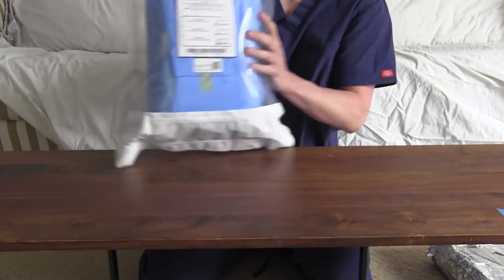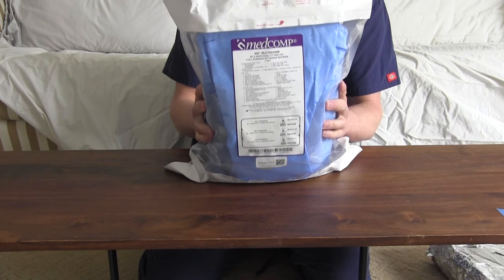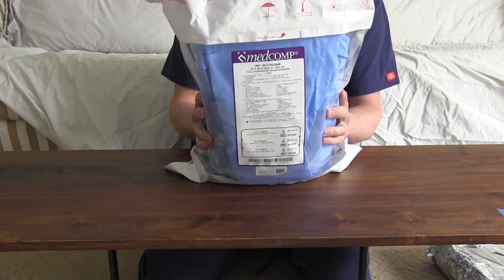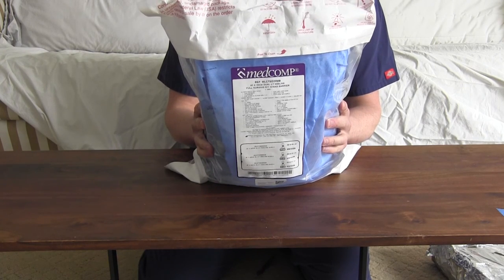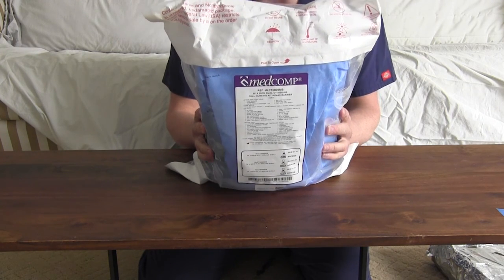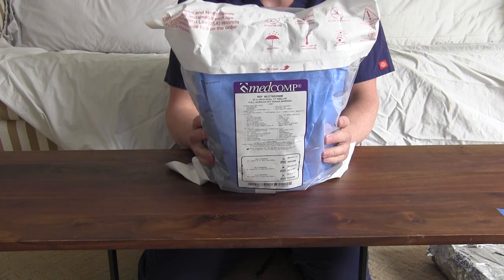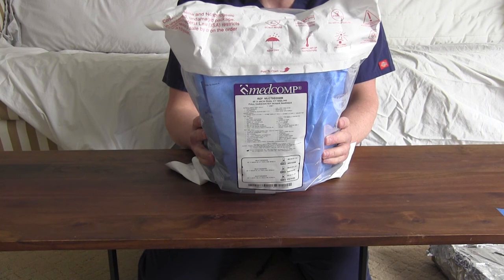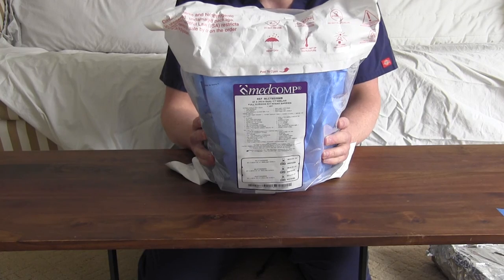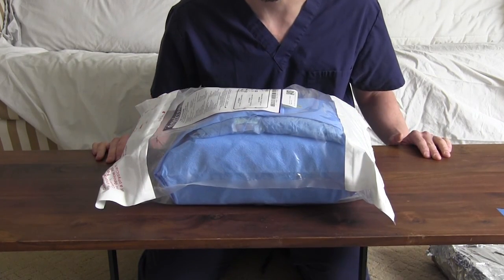Today we're going to talk about the MedComp Midline set. And this is a very good set. We are happy with this. And this allows you to do CT power contrast studies, as well as, at our hospital, administer vasopressors. So it's a good substitute for a central line. And it's a good substitute for patients you can't get peripheral access for and you want to do a CT scan. You could, for that case, use the shorter midlines, but we are not so happy with those.